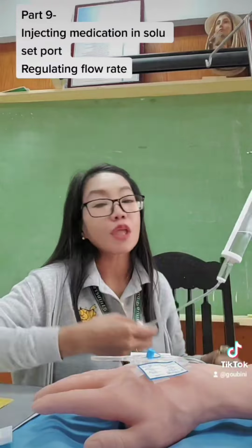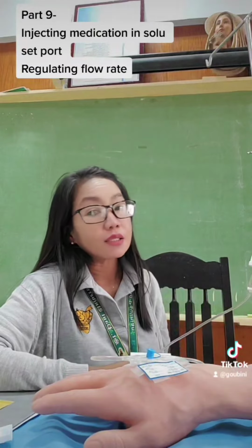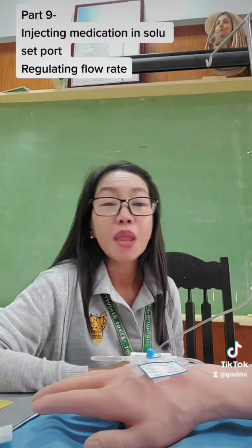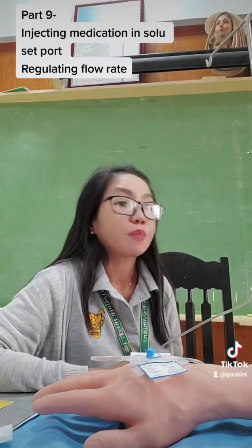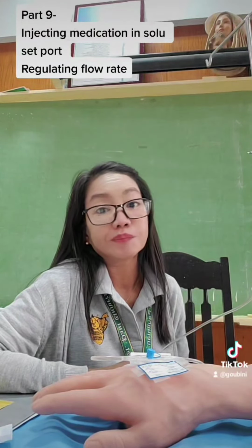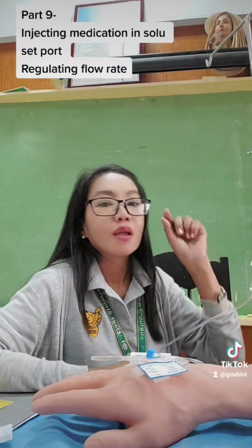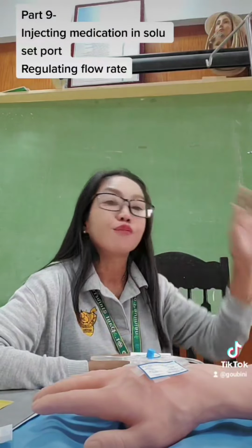Also, do not forget to evaluate the patient's response after the medication has been given. Watch for any signs of side effects or adverse reactions. For cefepime, you have to watch out for rashes, abdominal pain, nausea and vomiting, and many others. If the patient has complained, you need to evaluate that. That will be your patient's response to medication. Aftercare should be done after this medication, so you have to be there before 30 minutes, and you will close the regulator and remove your soluset.